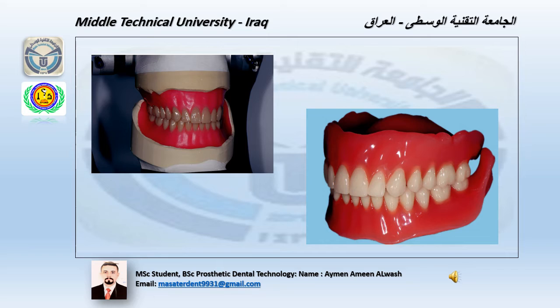After the dentist completes checking of the complete denture inside the patient's mouth, return the upper and lower wax pattern on the mounting and send to the dental laboratory. The dental laboratory completes this procedure by using the traditional way: flasking, finishing and polishing.